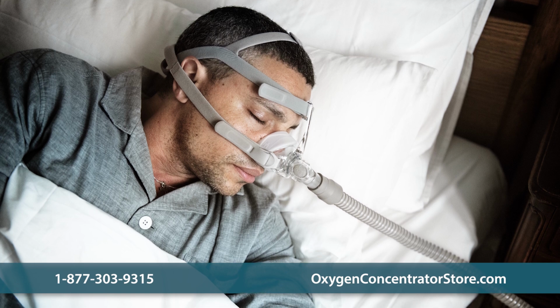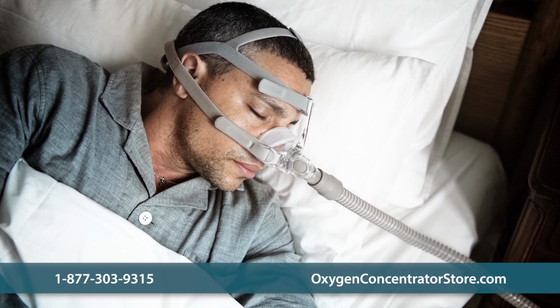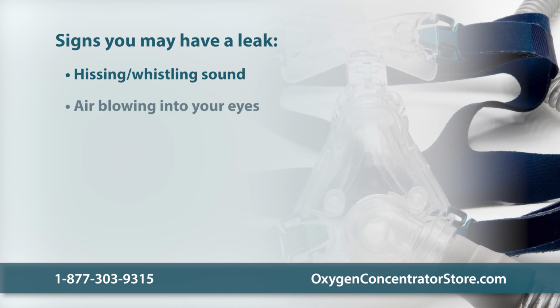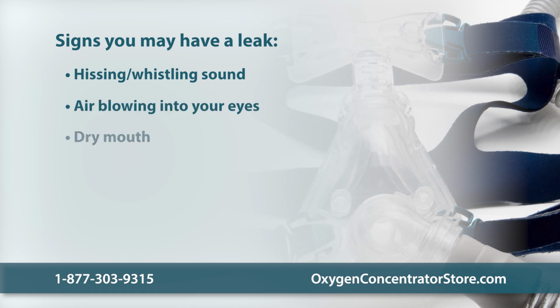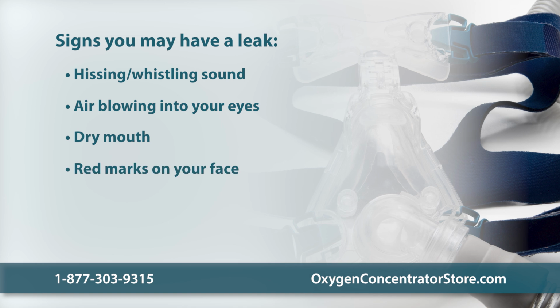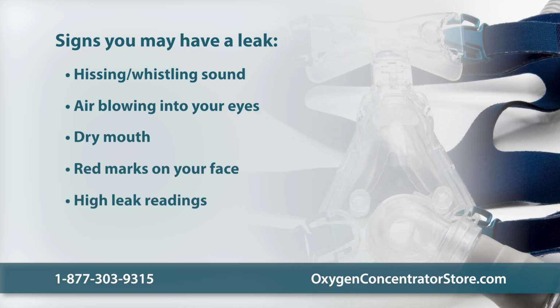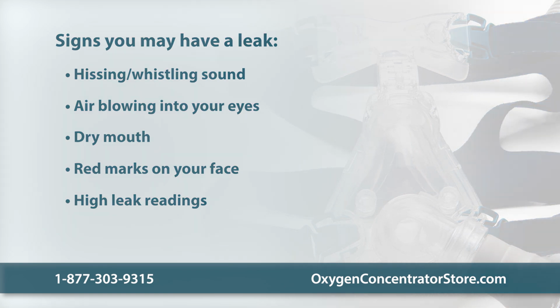You might notice one or more of the following if there is a leak while using your CPAP machine: a hissing or whistling sound, air blowing into your eyes, dry mouth in the morning, red pressure marks on your face, high leak readings on your CPAP display or app. If you're seeing these signs, it's time to troubleshoot.